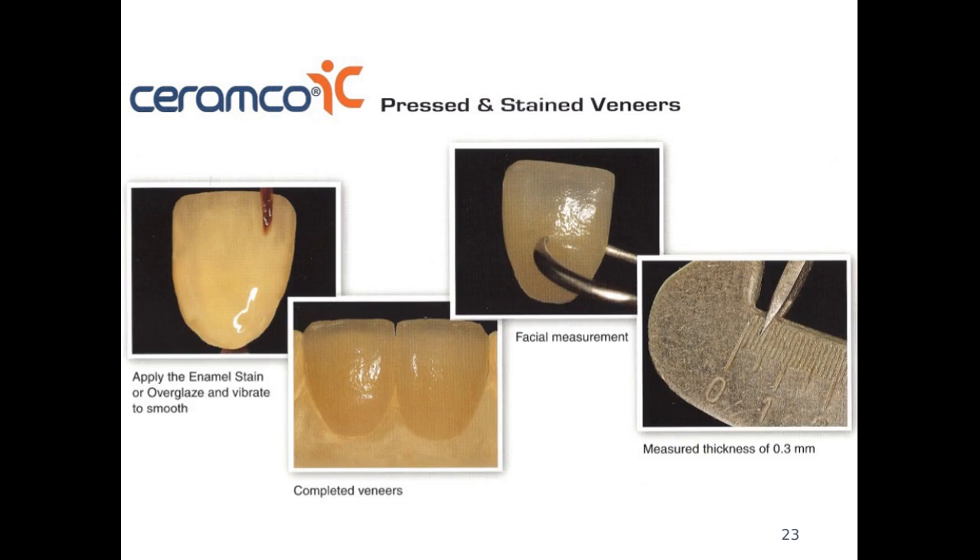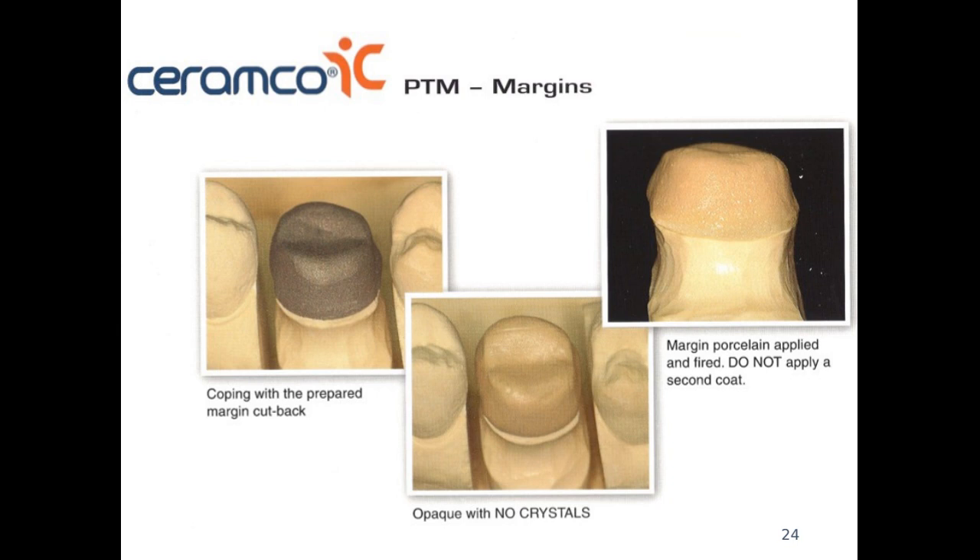This is how the veneer should look once completed — they are very thin and we can apply different characterizations to make them look natural. For margin porcelains, when applying shoulder porcelain we have to make sure there is enough room and we fire it at the proper temperature.